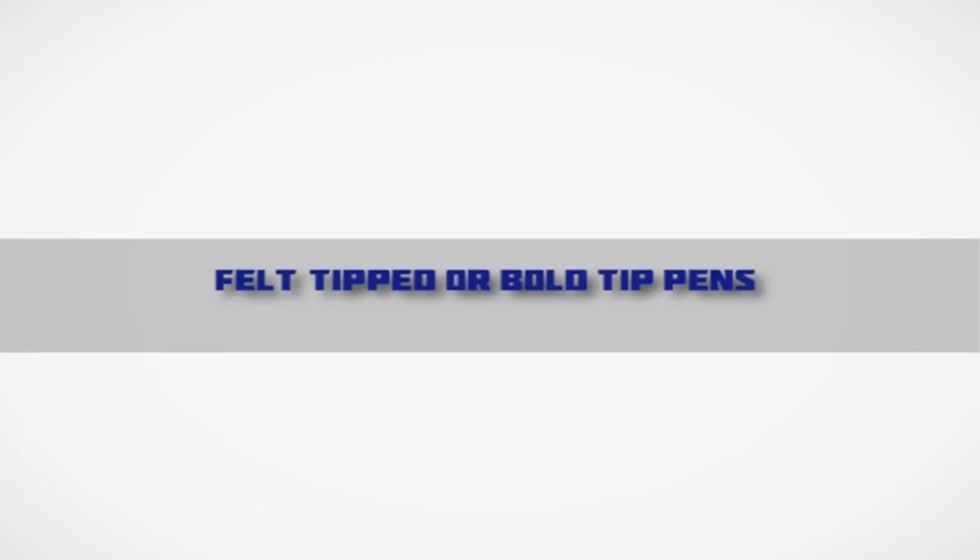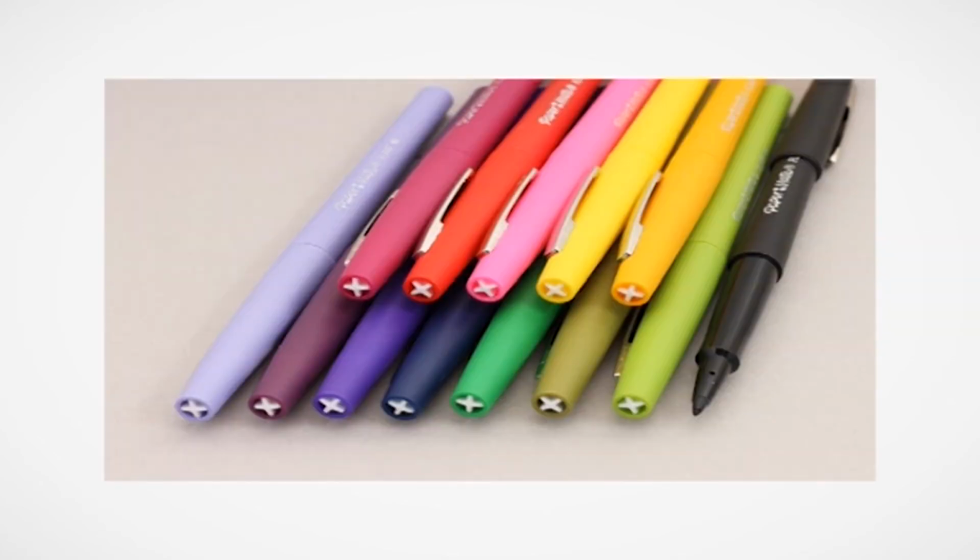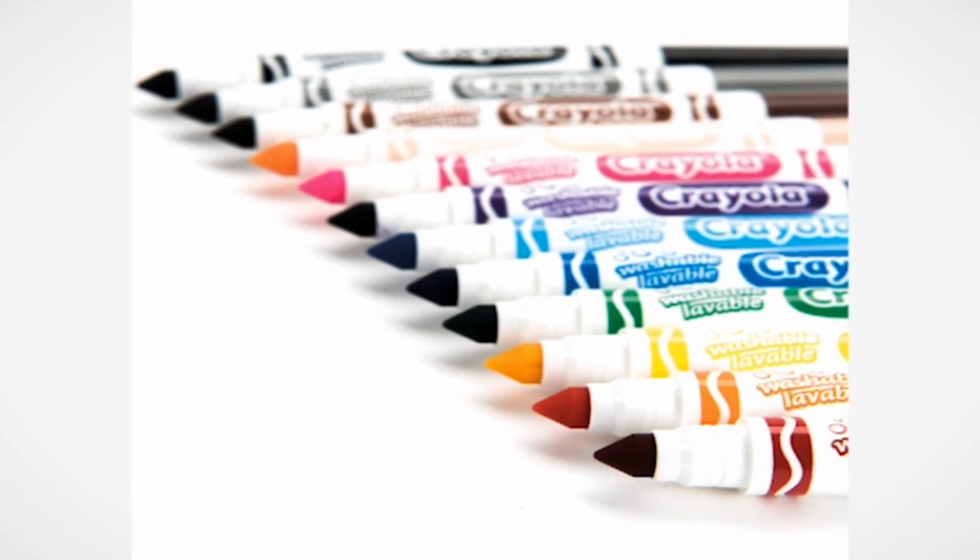Felt tipped or bold tip pens. The larger or bold tip writing pens form larger letters so that a low vision person can read letters and words more easily. In order to find the pen that works best for an individual, try experimenting with several different brands and tip thicknesses until you find one that best meets the writing needs.